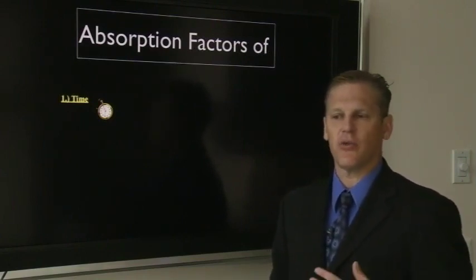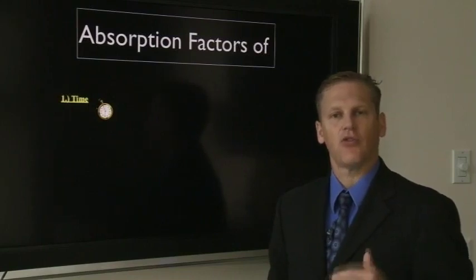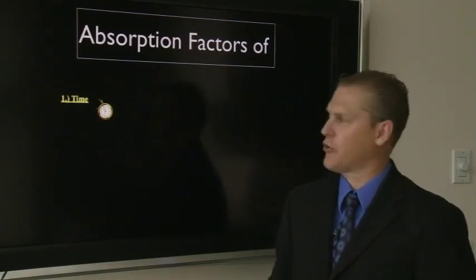So again, you want to try and use the lowest power possible, but at the same time, try and minimize the amount of time that you're interacting with the tissue to minimize the lateral thermal damage that will occur.